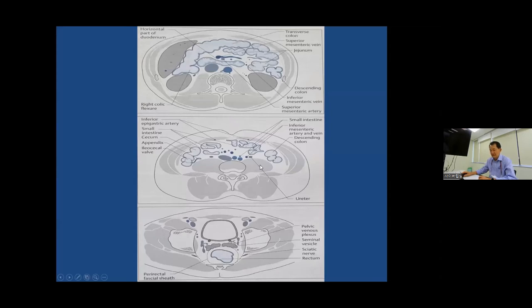If you go down a little bit, then you have the mesentery. It's another apron-type peritoneal tissue, and has lots of fat and also lots of vessels. If there is any peritoneal seeding or peritonitis, you expect to see some kind of hazy, fatty tissue on CT. Fat density is generally dark, but if there is some haziness, then you have to think about peritonitis or peritoneal seeding.